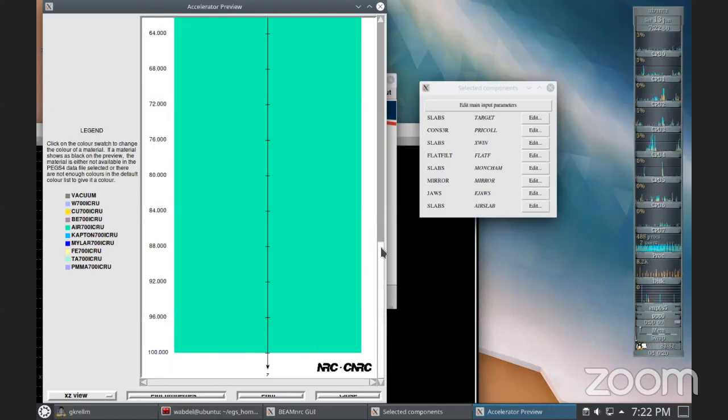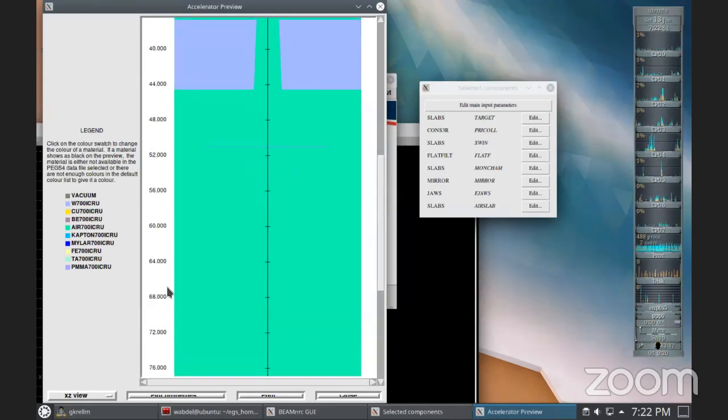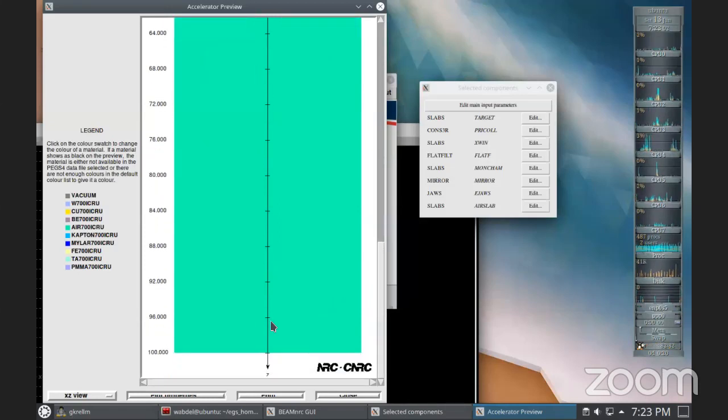Okay, sometimes some people will actually take it up to 70 centimeters, so that if they want to do an SAD calculation, they can do that. But if we're doing an SSD calculation, 100 centimeter SSD, then you would probably take the simulation there. This is especially important at the beginning when you want to optimize your linear accelerator.